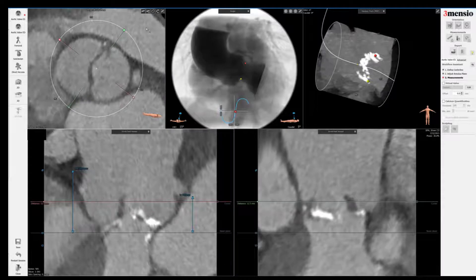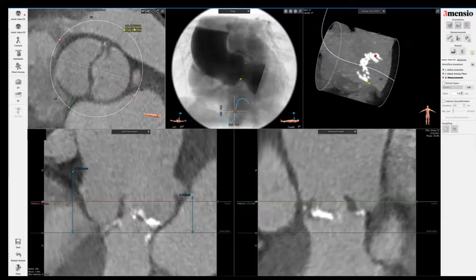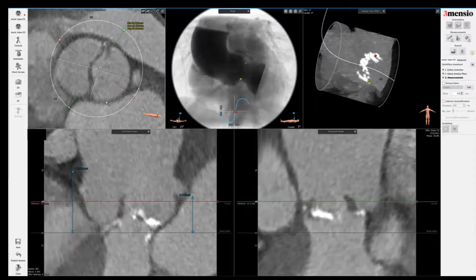Cut the sinuses of Valsalva height in half. In this case it's not going to be free sinuses, so I'm just going to draw a line across the maximum portion across the two sinuses and then the perpendicular intercommissural distance. Some people talk about supra-annular sizing — I still do annular sizing here. I also measure intercommissural distance to take a look, because this is a very large root compared to the annular dimensions, so I certainly wouldn't size based on the intercommissural distance.